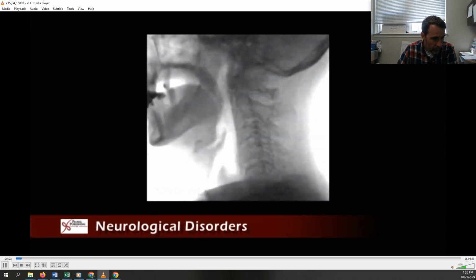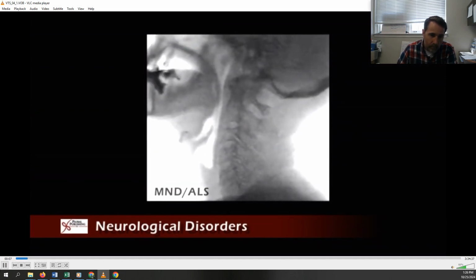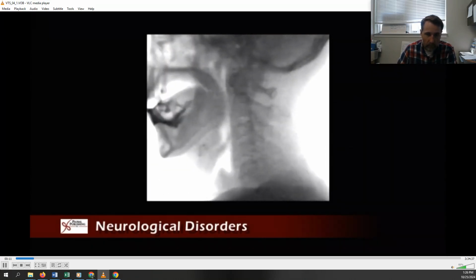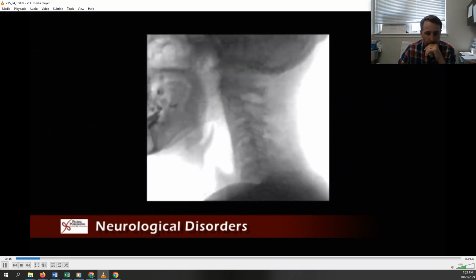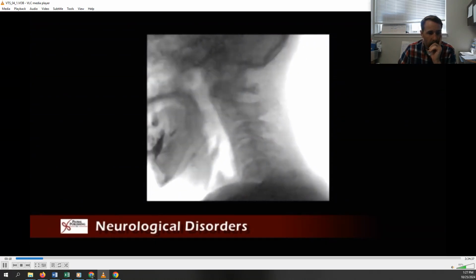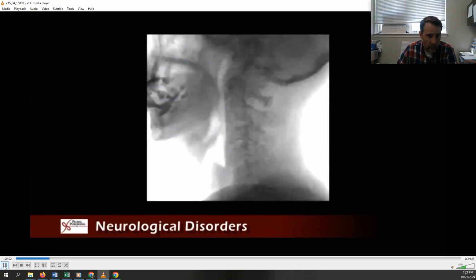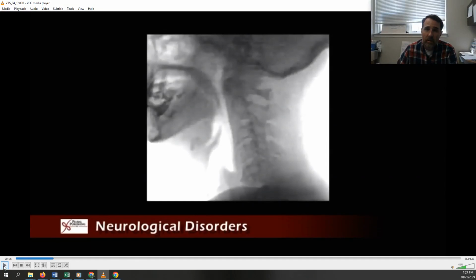This 56-year-old man had a 1-year history of terminal bulbar onset motor neuron disease. He presents with a moderate spastic dysarthria and has very little functional movement of his tongue due to upper motor neuron involvement. As his swallow is deteriorating, he reports coughing on saliva and is beginning to lose weight. All right, so very little movement of the tongue, which we're going to see negatively impacts his oral stages.